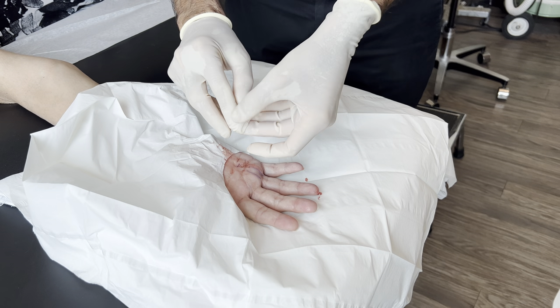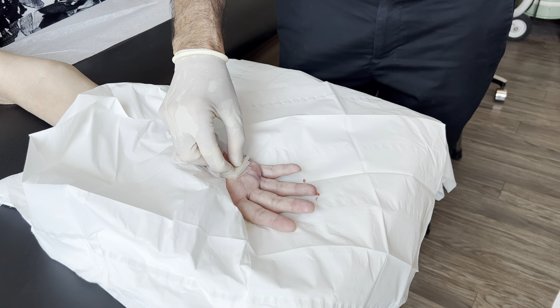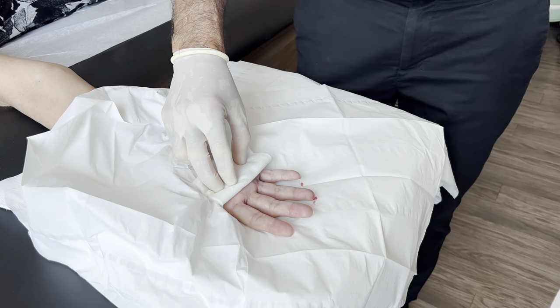Yeah, there may be a little bit of tissue that has to be worked out, but it's cut. It takes a while for it to feel really perfect. And that's the end of the procedure. Thank you. Thank you.